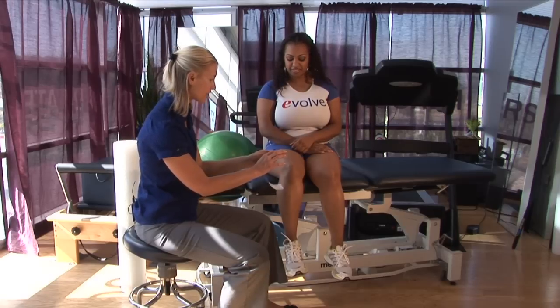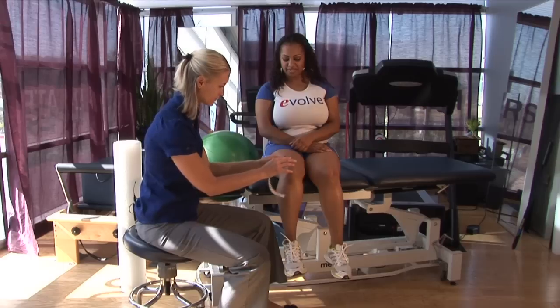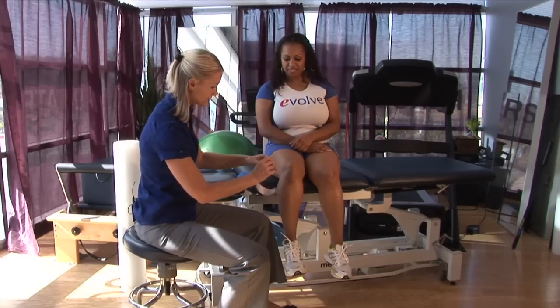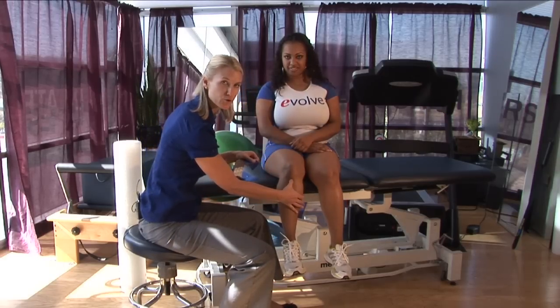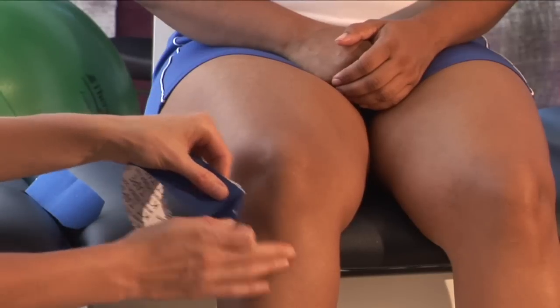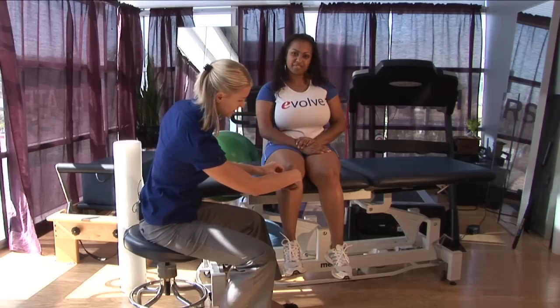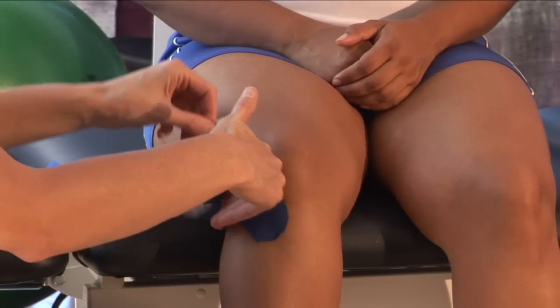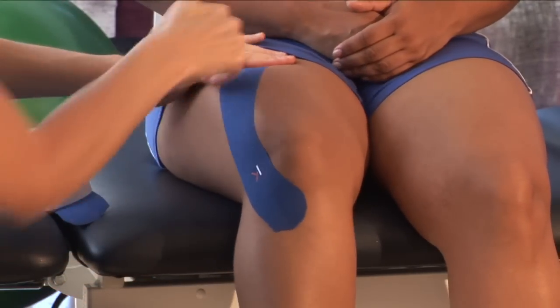I'm going to peel part of the backing off of the tape. I'm going to find the tibial tuberosity, the little bone or protrusion below the kneecap, place the tape there, tack it down, and as I peel the backing off I'm going to come around the kneecap and all the way up to the quad, leaving no tension at the end.